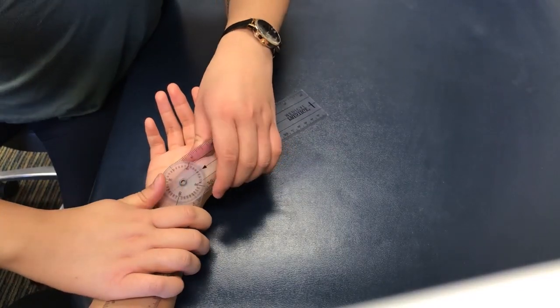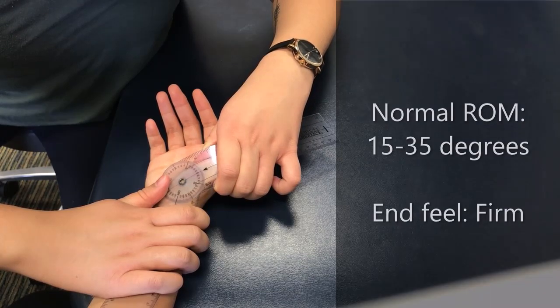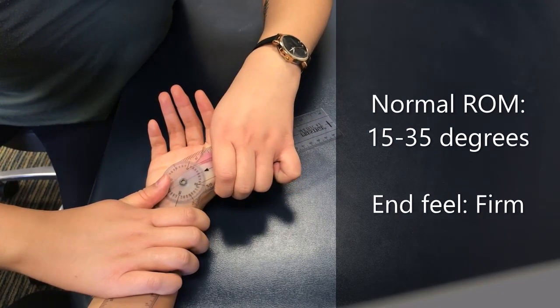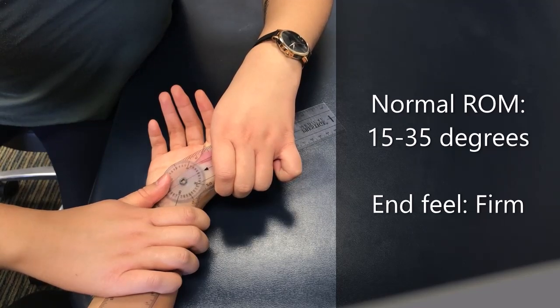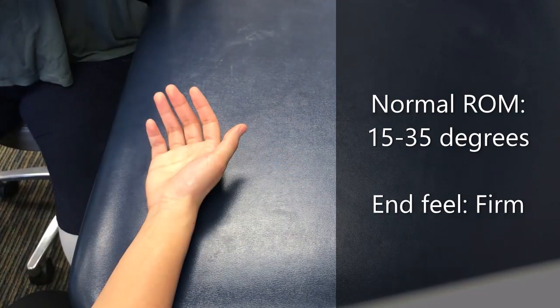And then for passive range of motion, just pushing into end range. And we're at 46. So the difference between 30 and 46 is 16 degrees.